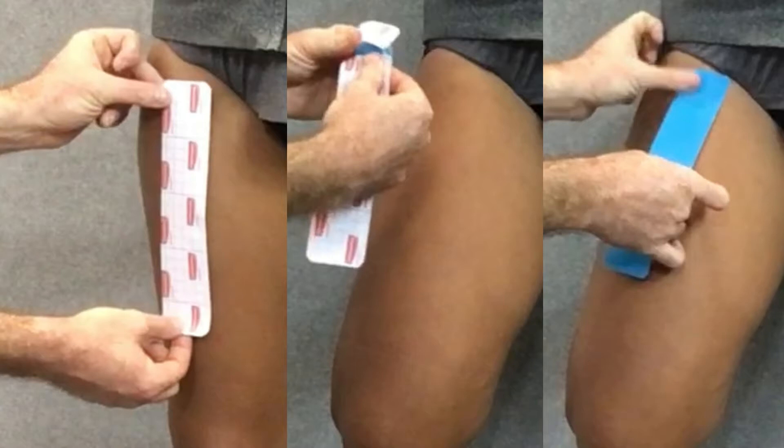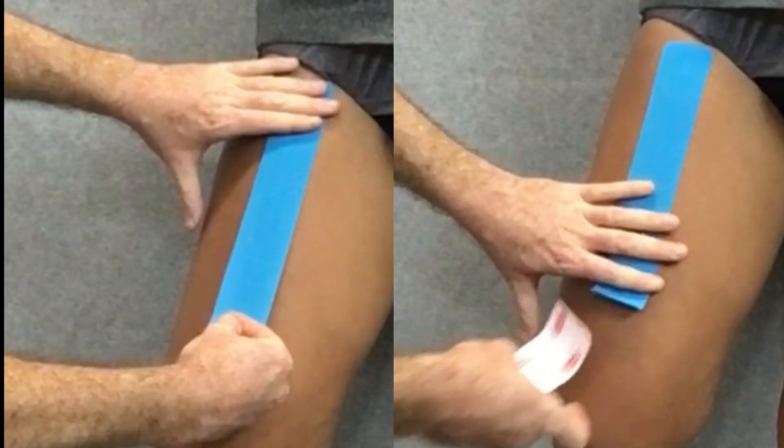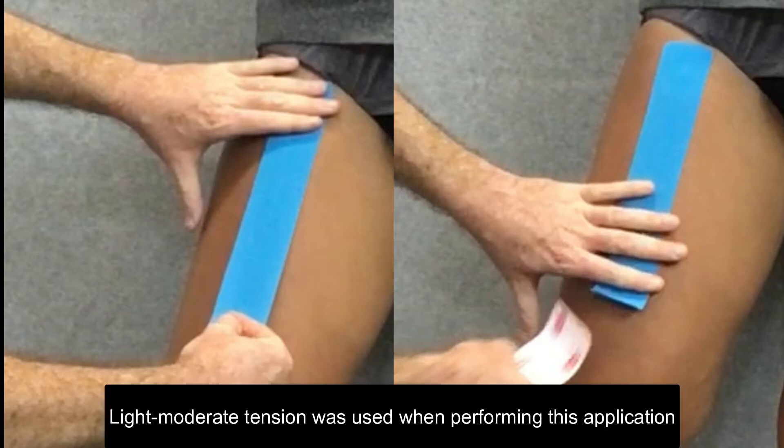We're going to tear the paper backing of one strip about five centimeters from one end and anchor that strip at the top of the thigh with it directed down toward the knee. Starting with this first central strip, once anchored, we peel the paper backing back to about five centimeters to hold onto and run the strip down the front of the thigh with just paper-off tension, then apply the end with no tension.